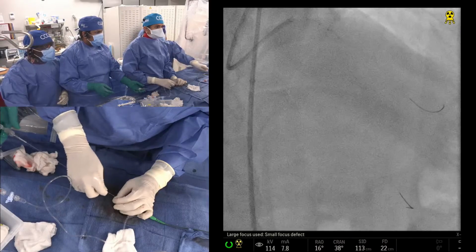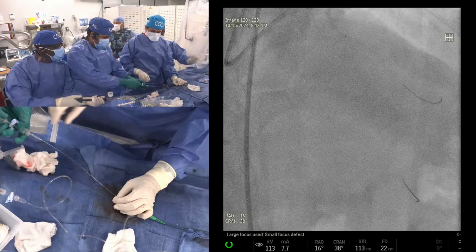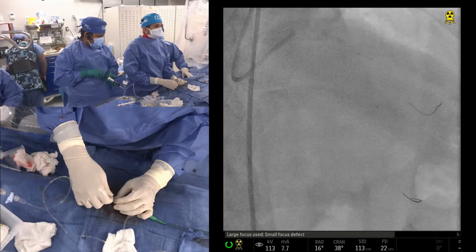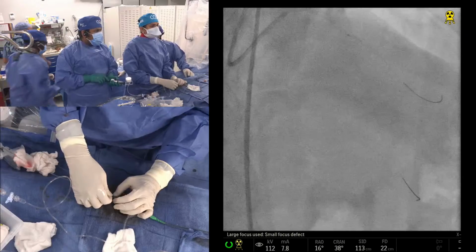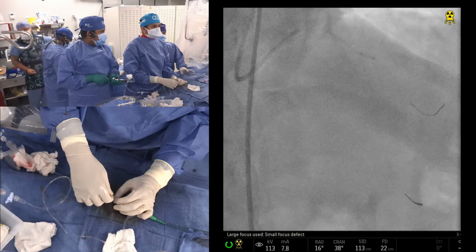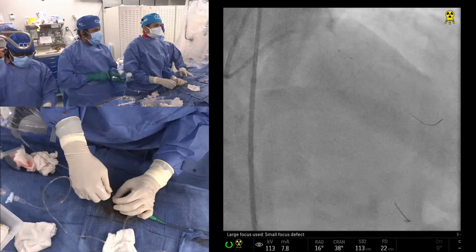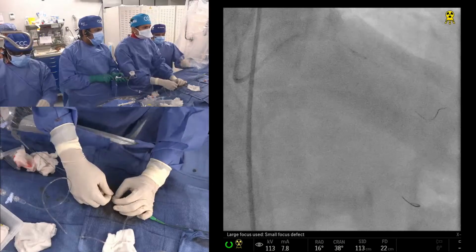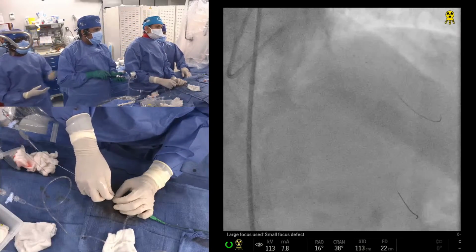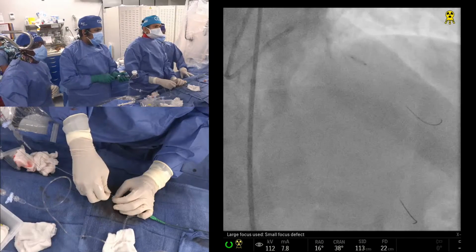And I can tell you, just when we took the catheter out of the femoral artery, there was a clot in the femoral artery. I had to aspirate. There were two big chunks. This is in a patient whose ACT was originally 285, and now 350. Because it is a CTO we give less. We don't give a full bivalirudin bolus. We give two-thirds, and that's what we're doing in this case, and keep ACT above 300. Once you are done, they add an additional bolus, and now it's the full dose, and ACT is now 320 plus.